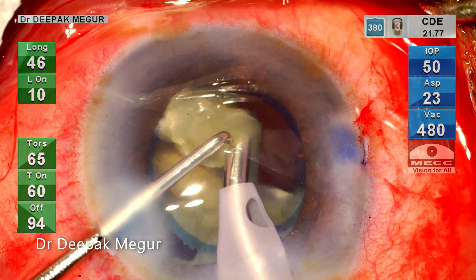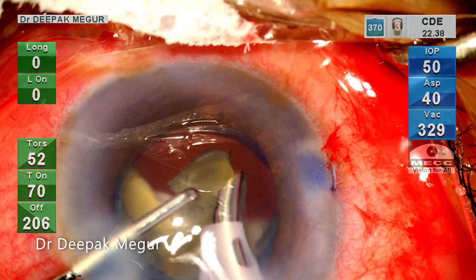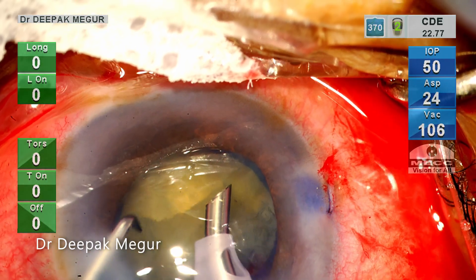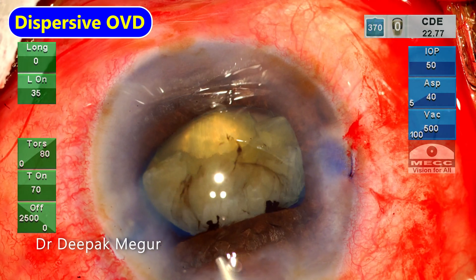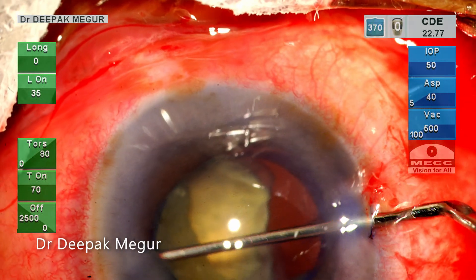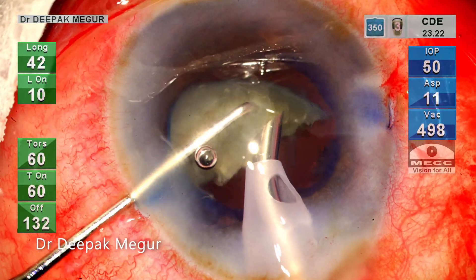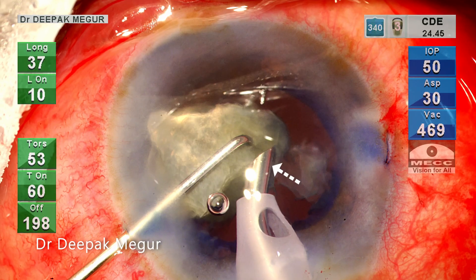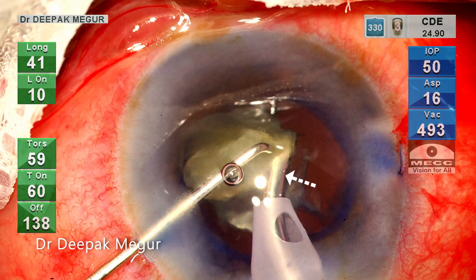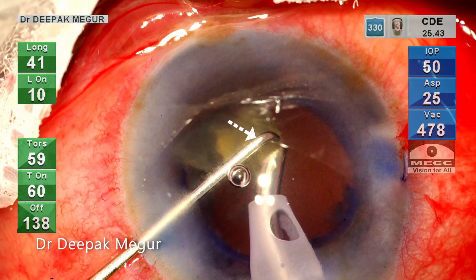I'm keeping one eye on the fragment which is dancing around the tip. The fragment occasionally rubbing against the pupil is a reassuring sign that the plane of emulsification is all right. Injecting OVD after emulsification of each fragment slows down the procedure considerably, but it is truly worth it. The last fragment is emulsified in a very controlled manner. The bevel of the tip is facing sideways so that the entire surface area of the lumen of the tip is exposed to the fragment. My second instrument is always held on top of the fragment being emulsified as a guard.